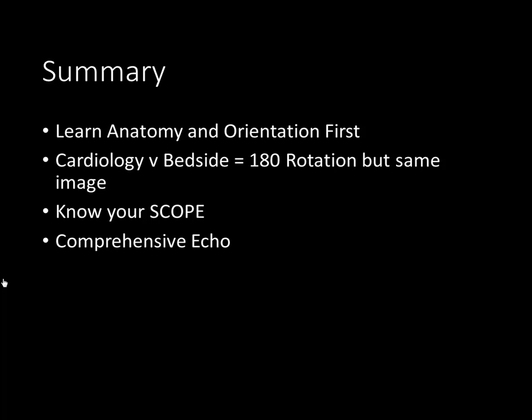Please be sure when you are practicing that you know your scope, and when indicated, make sure to order a comprehensive echo to fully interrogate the heart and get all the information you need to treat your patient.